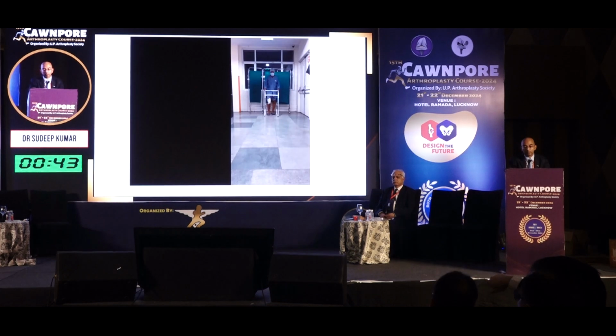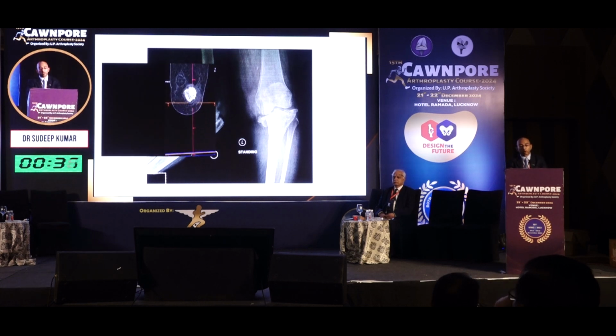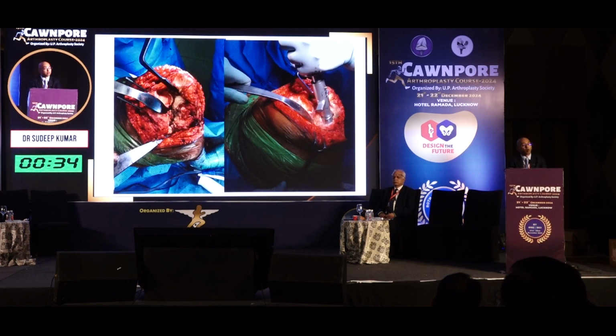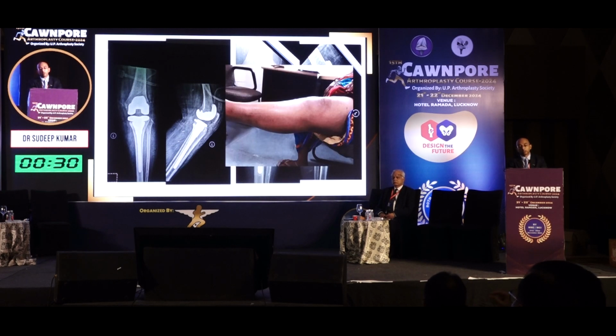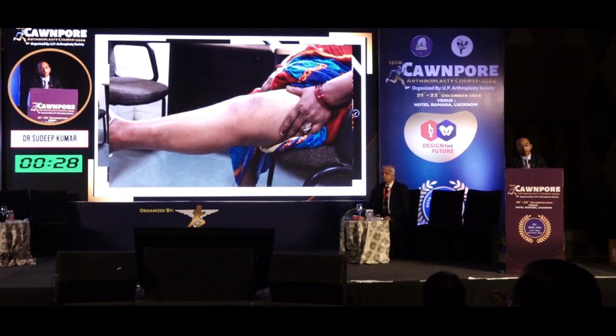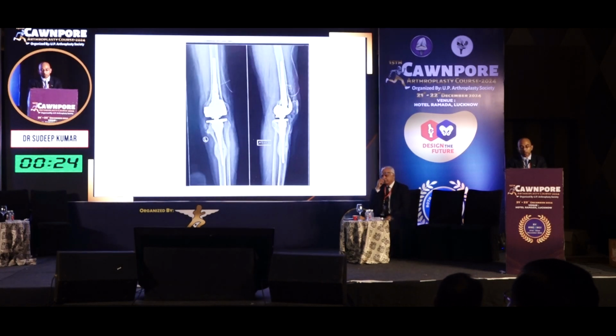of construct. So a patient like this, who crumbles over their own weight, she completely collapsed, with complete loss of the central part of the tibia. We used this, and this is around 7 years of follow-up of this patient, and the patient did very well. This is just a recent surgery that we did last week, where we used a hinge knee because the defect was too much to handle and it was too steep.